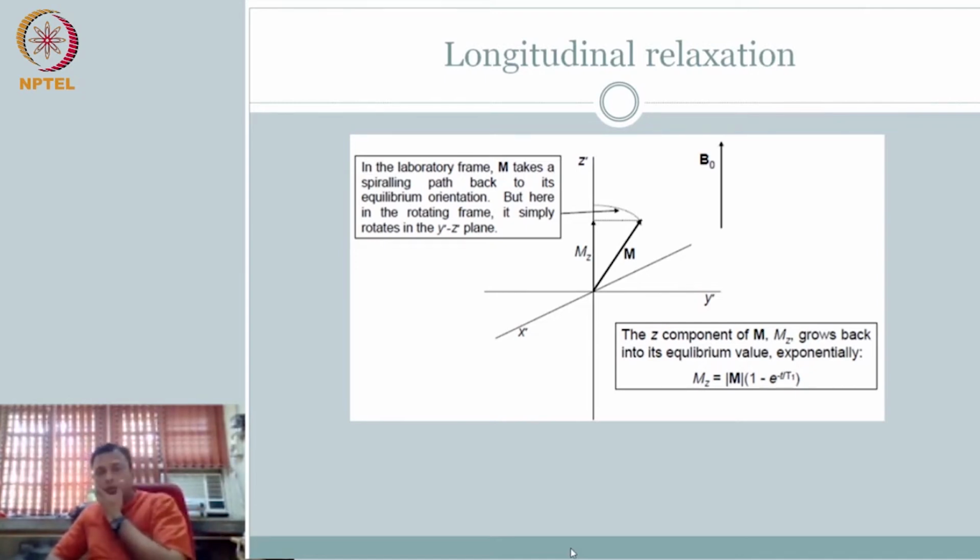Okay. So now the question is, I can play this game every time. I can allow the excitation, push it down, record the signal, no issues. But now the question is, there's one more capability that we can do that will allow us to notice this T2 or T1. Both of these are also characteristic of the material, right? Or the sample volume. So if you're talking about hydrogen, if the neighbors are slightly different at that location, then you're going to have a different T2, right? And so also depending on the loss, you're going to have different T1.